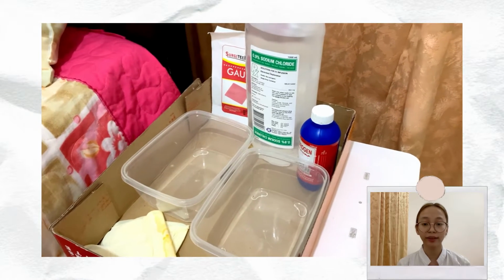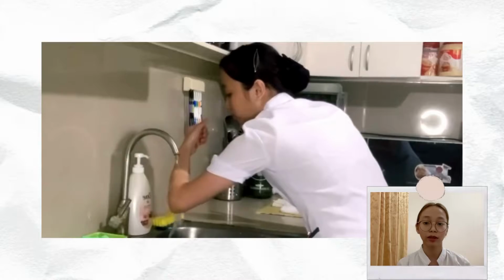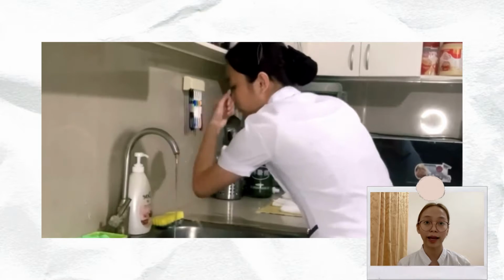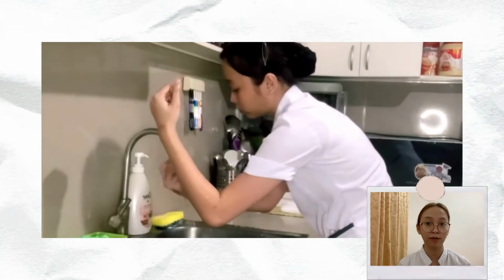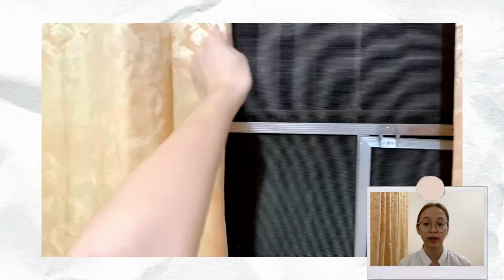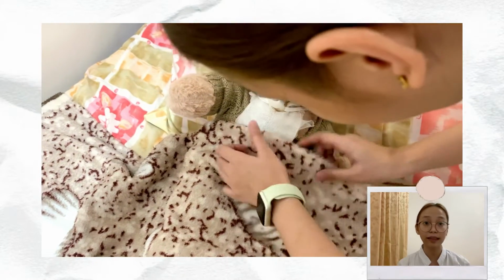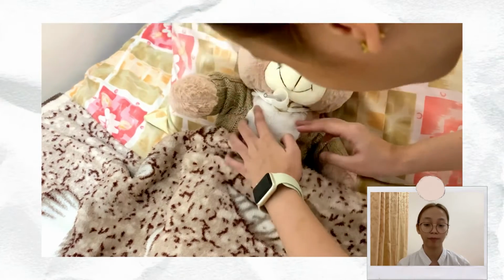For the implementation, number 1, bring necessary equipment to the bedside stand or overbed table. Number 2, perform hand hygiene and put on PPE if indicated. Number 3, identify the patient. Number 4, close curtains around bed and close the door to the room if possible. Number 5, determine the need for tracheostomy care.